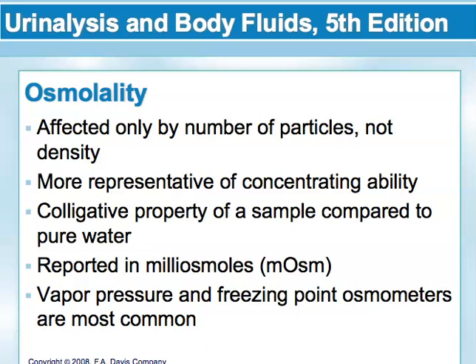Okay, osmolality, which is a direct method, is affected only by the number of particles in the solution, not the density of the particles. So this is a more representative determination of concentration ability. In this method, urea, sodium, and chloride all contribute equally to the measurement since molecular weight does not matter.